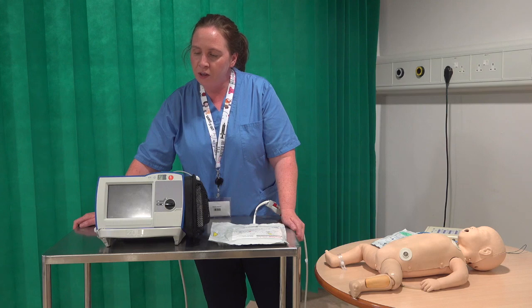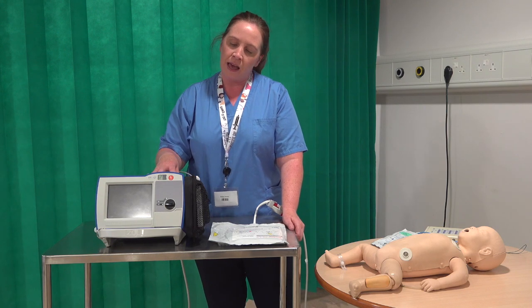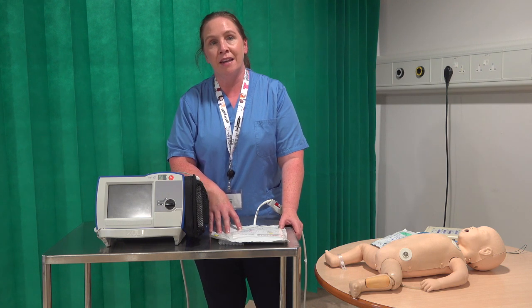Good morning folks. I want to chat to you about how we're going to use this machine up in NICU. As standard you will have your machine attached to an adult set of pads, and that's primarily to facilitate the machine checking every morning at 8 o'clock, so staff just need to do a quick visual check.